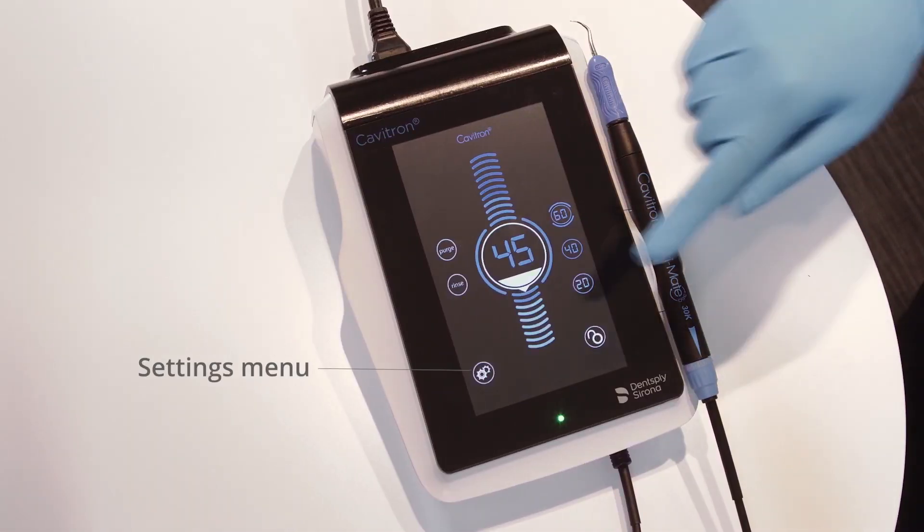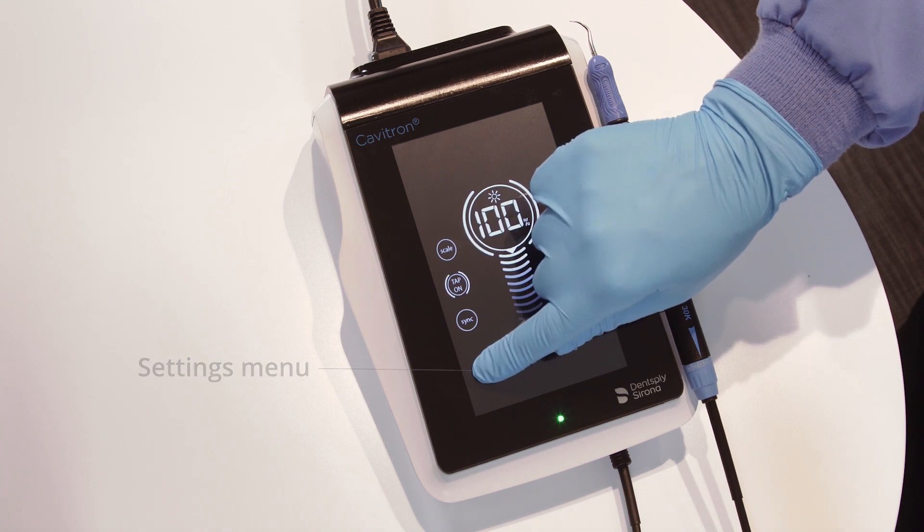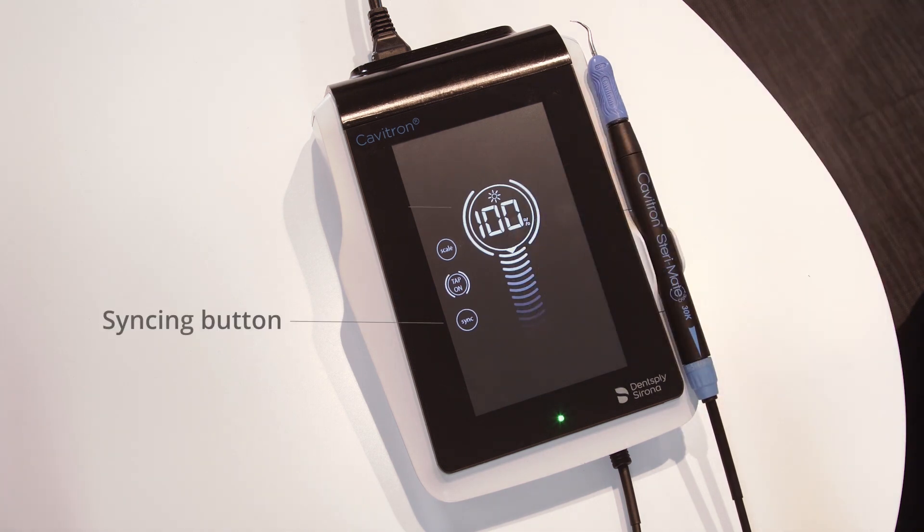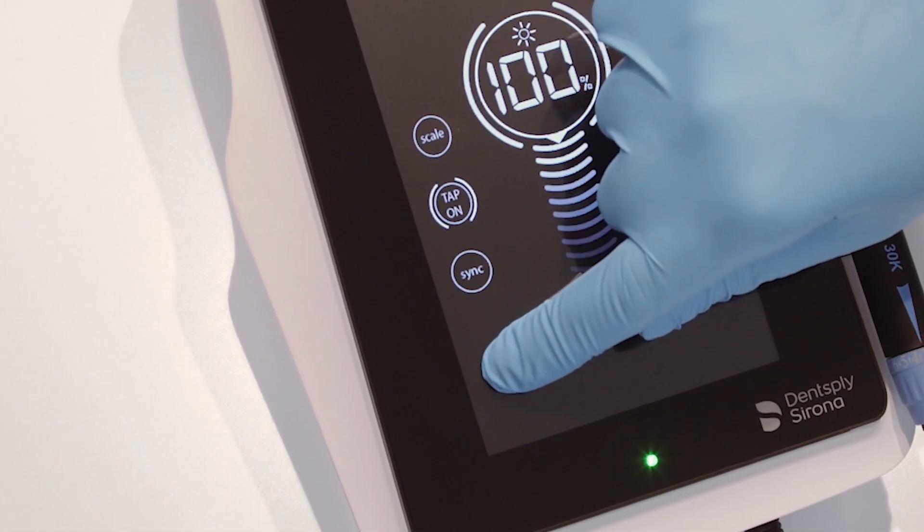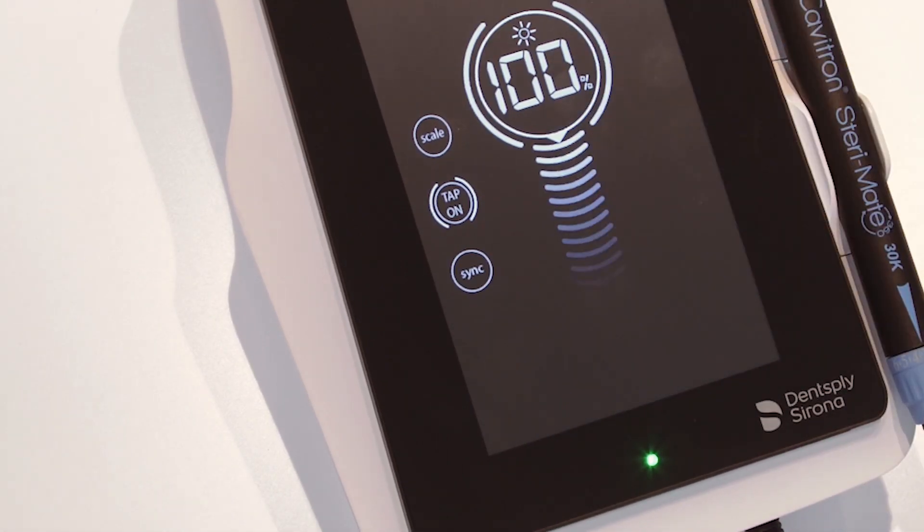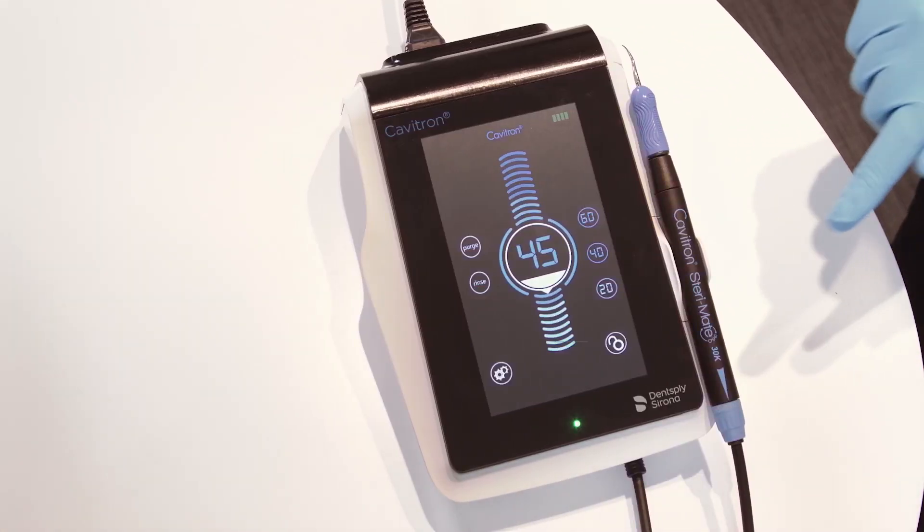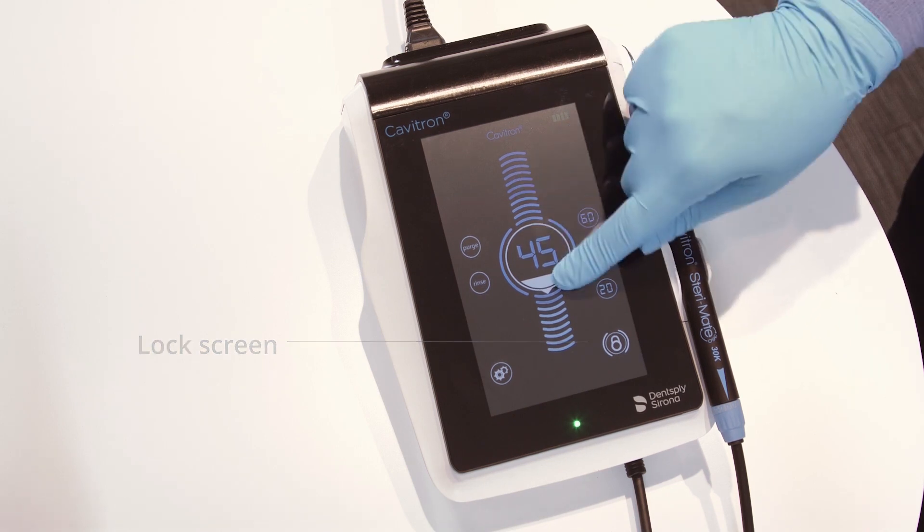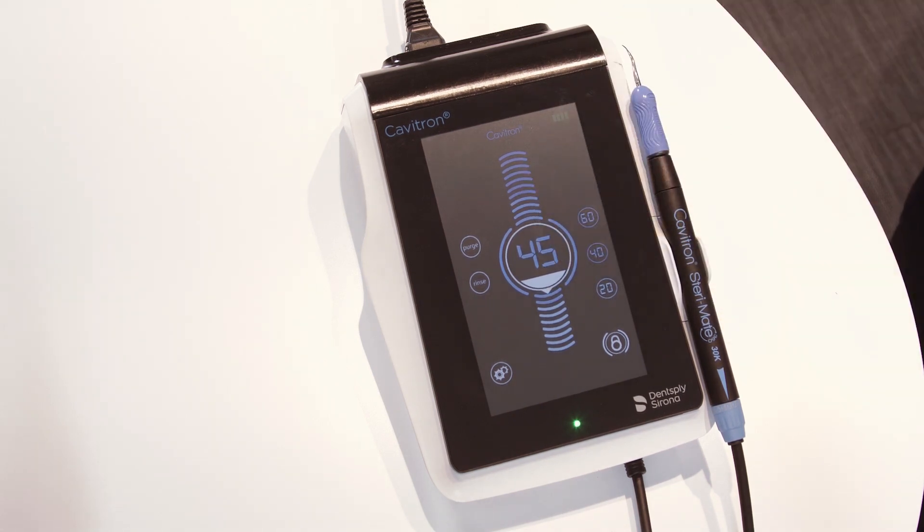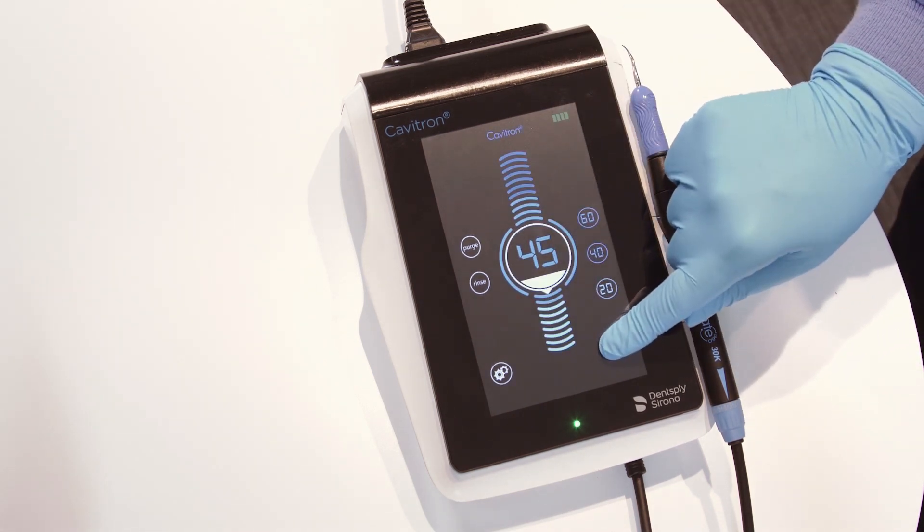The settings icon accesses the menu allowing for syncing of the foot pedal to the unit, brightness setting and the tap on technology foot pedal control setting. To access the settings menu, press and hold the icon for two seconds. The lock icon is pressed and held for two seconds to lock the screen, disabling adjustment of any parameter until the unlock icon is pressed and held for two seconds.